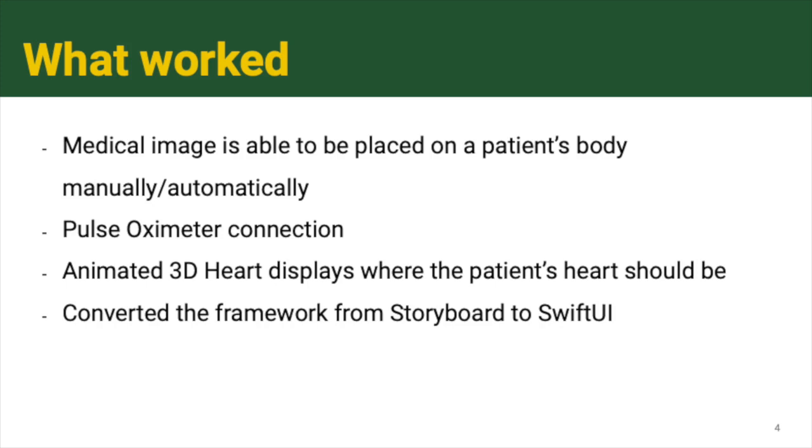Secondly, the driver for the pulse oximeter is working properly. The driver is designed so that the app can automatically connect the sensor without any human interaction. By seamless connection towards the sensor, we were able to get the physiological data such as the heart rate and the blood oxygen value for further processing. However, we found that this independence of human interaction can be a limitation. Further work is required as we will explain below.